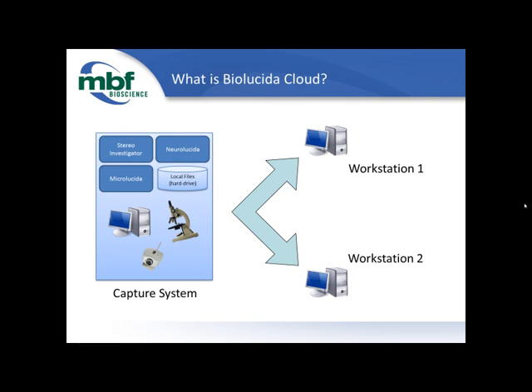Now, I've been able to work with Biolucida Cloud for some time now, and these are problems that Biolucida Cloud is really, really good at solving. It's with the click of a button, one or more images can be uploaded, categorized, and then accessed from any network computer, including over the web. Jeff, let's take a closer look at the components that make up Biolucida Cloud, shall we?